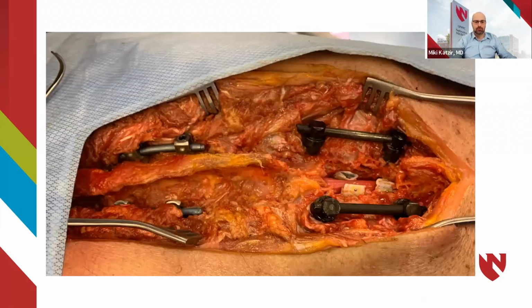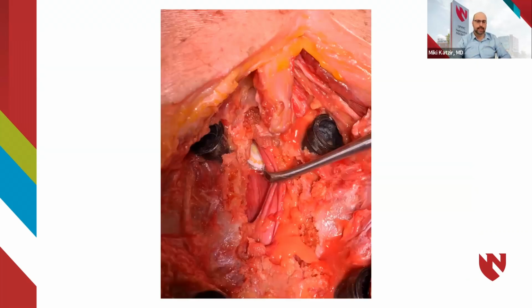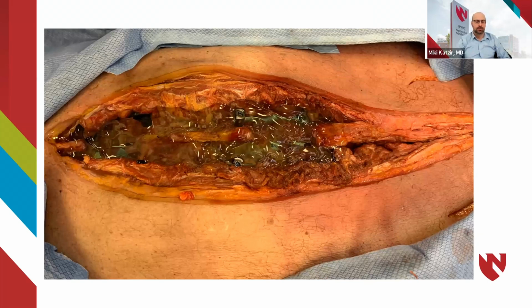And we took a thoracic spine, we exposed it, and two segments were instrumented with rods and screws, carbon fiber on the right of the screen and titanium on the left. Dosimetric chips were installed in the epidural space. And here I'm retracting the thecal sac. You can see the carbon fiber screws at the top, the dosimetric chip ventral to the spinal cord or the thecal sac. And then we filled up the space with gel, so no air will be there.